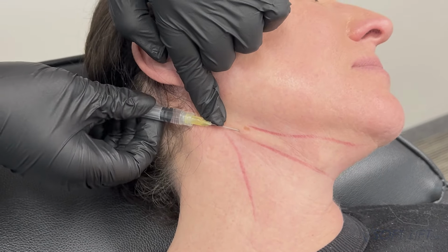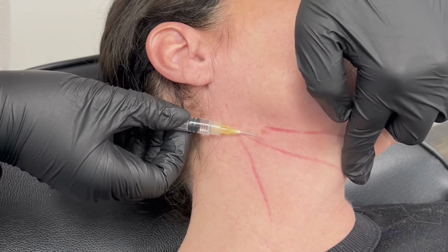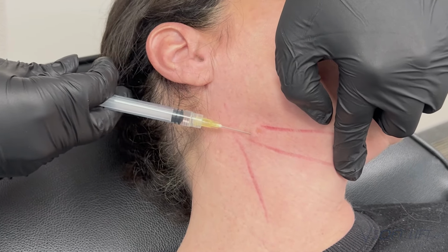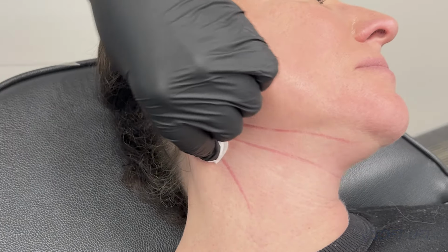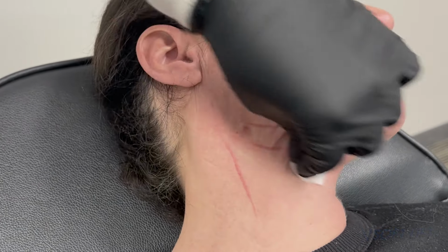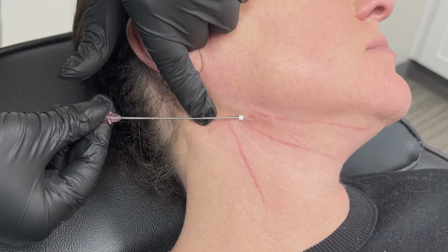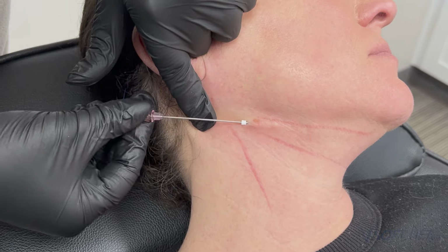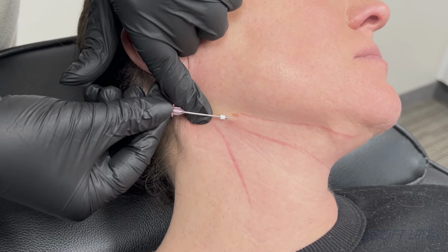So now I'm going in with a 22 gauge by 75 millimeter length ComfortOx cannula. And I'm leaving lidocaine in my vectors to get her good and numb. I then am going in using a VSoft Arte 1 18 gauge by 100 millimeter length lifting thread.